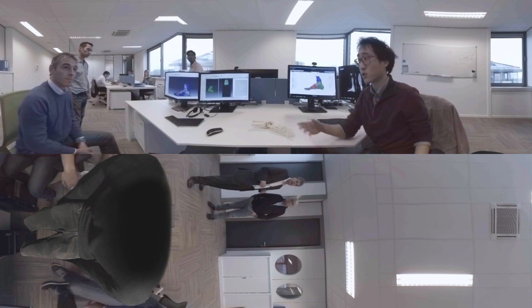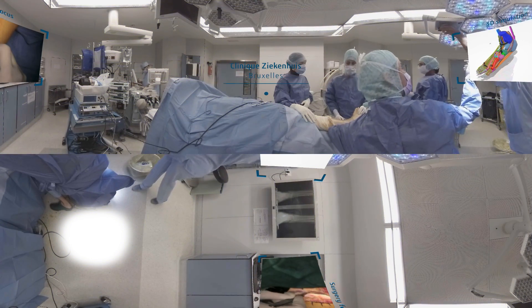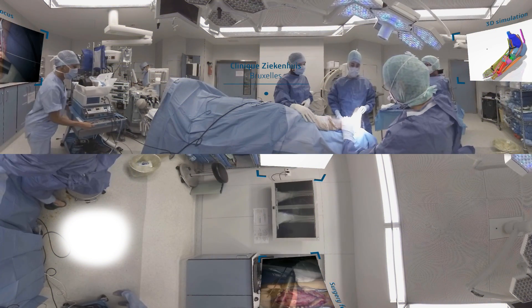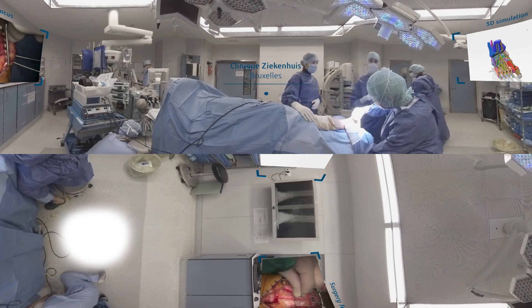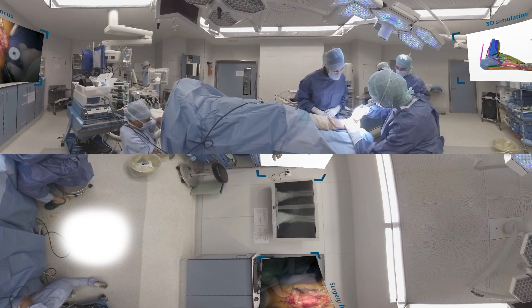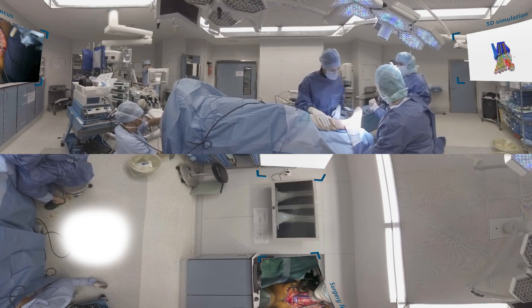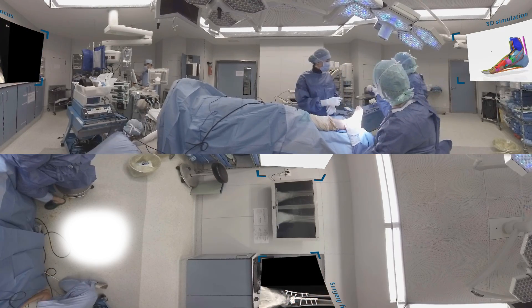Let's go to the surgical part — you will now go to the operating room. A supramalleolar osteotomy was performed. The aim of this procedure was to realign the articular surfaces of the ankle in order to correct the malalignment of the hind foot.